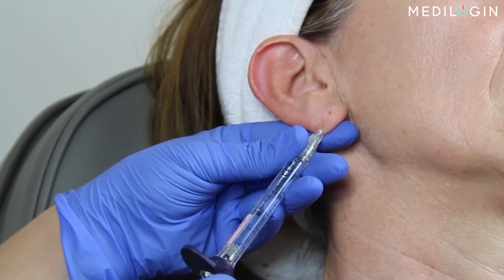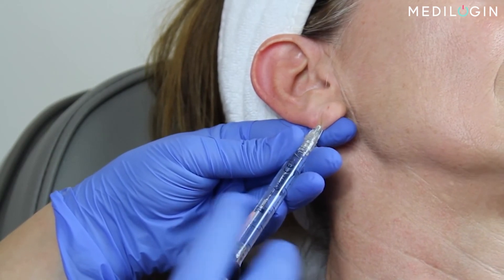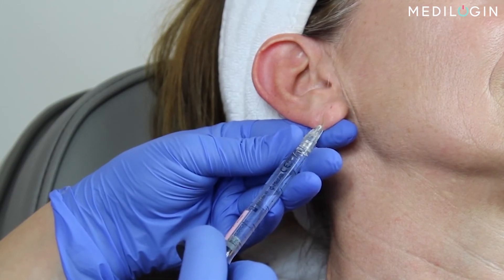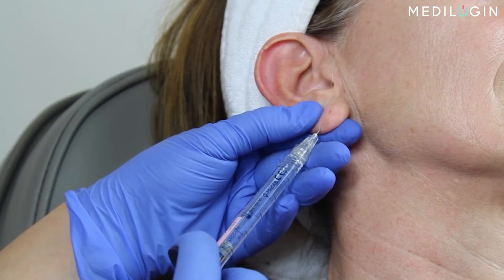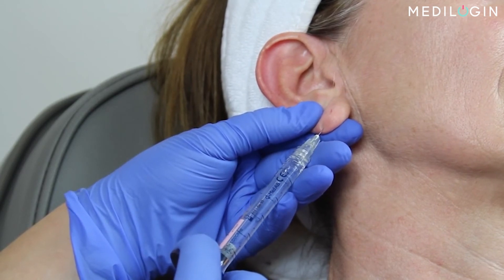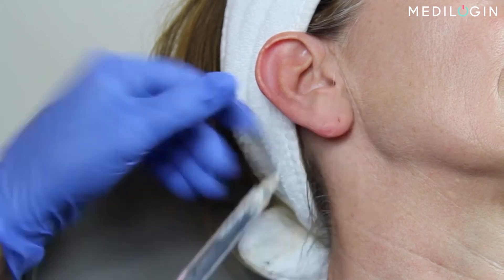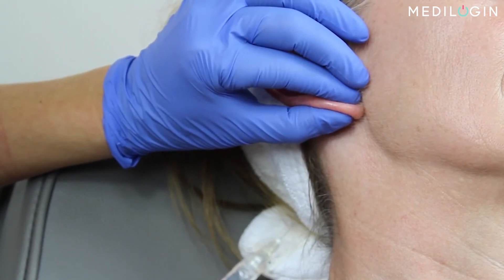First aspirate, then slowly inject a small bolus of hyaluronic acid. Slowly retract the needle and inject the product once more. Then apply gentle pressure, and massage the area.